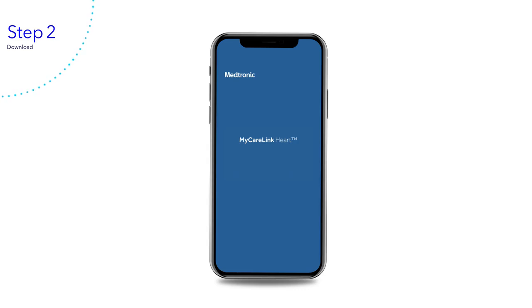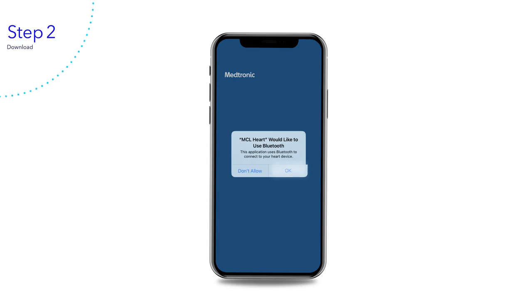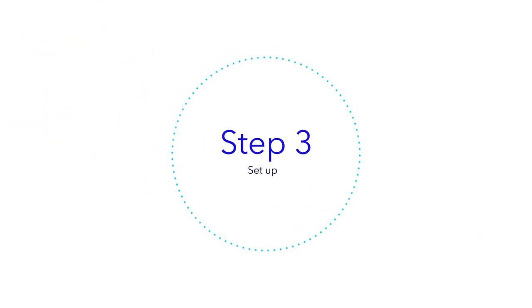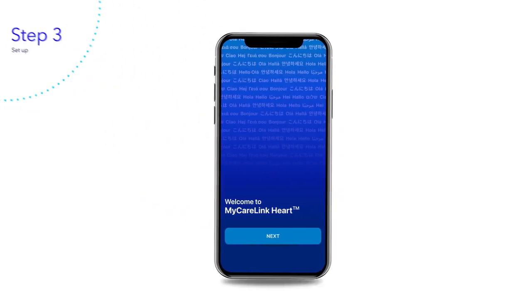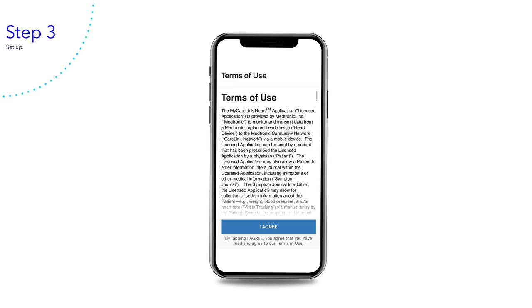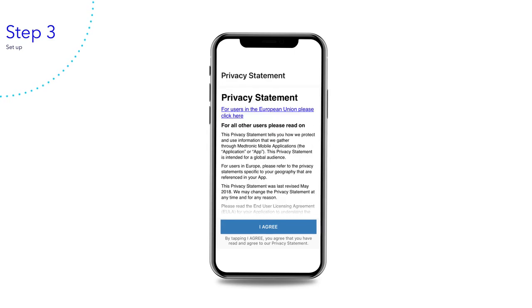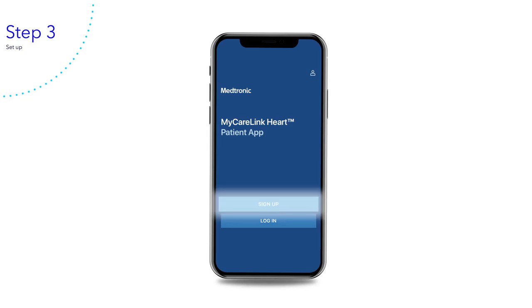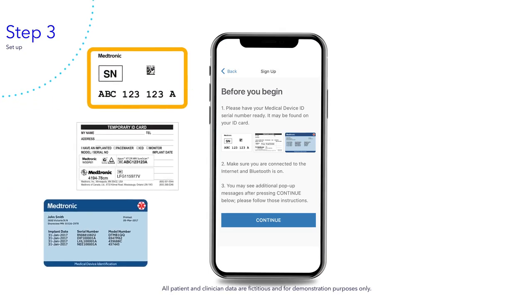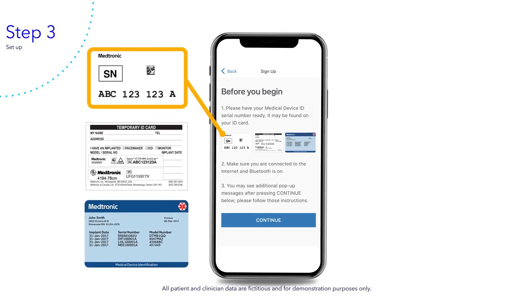You will see a Bluetooth confirmation message — select OK. Follow along with these steps to connect the MyCareLink heart mobile app with your heart device. Please agree to the terms of use and privacy statement by tapping I agree. Tap sign up to begin the setup process. Remember to have your medical device ID card ready — it has your serial number that you need to sign up.